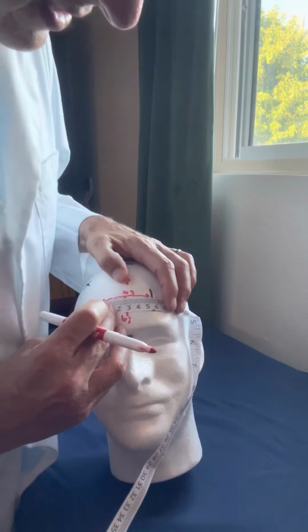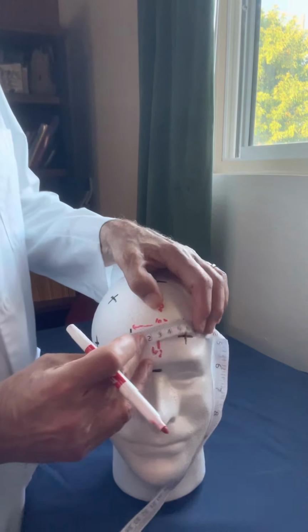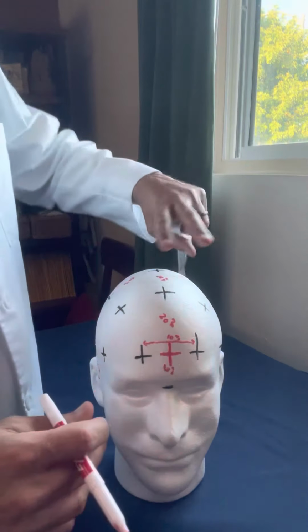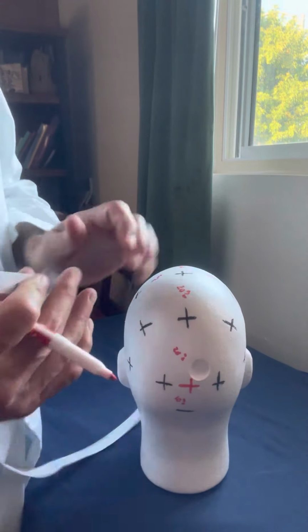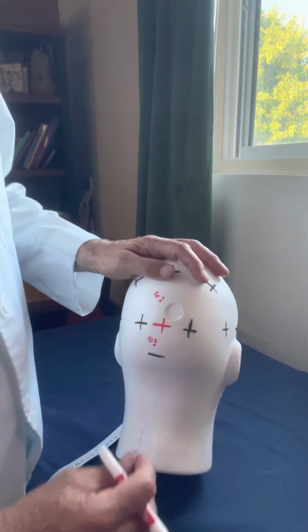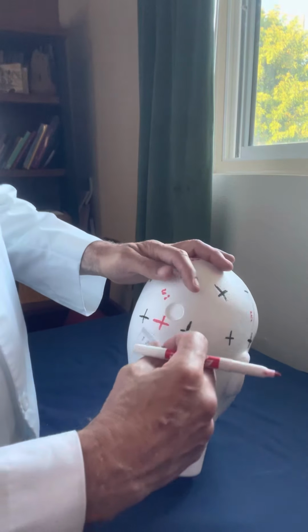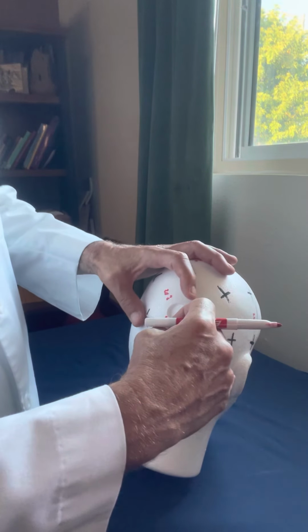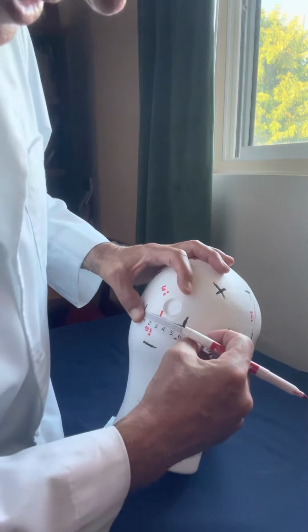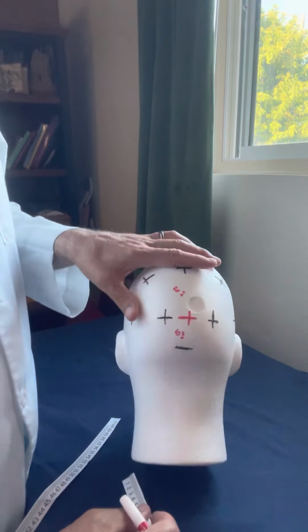And I get exactly 5.5 centimeters from FP1 to FP2. And the same thing in the back: the distance between O1 and O2 should be 10% of the circumference measurement, which would be 5.5 centimeters again. And here I have about 5.7.